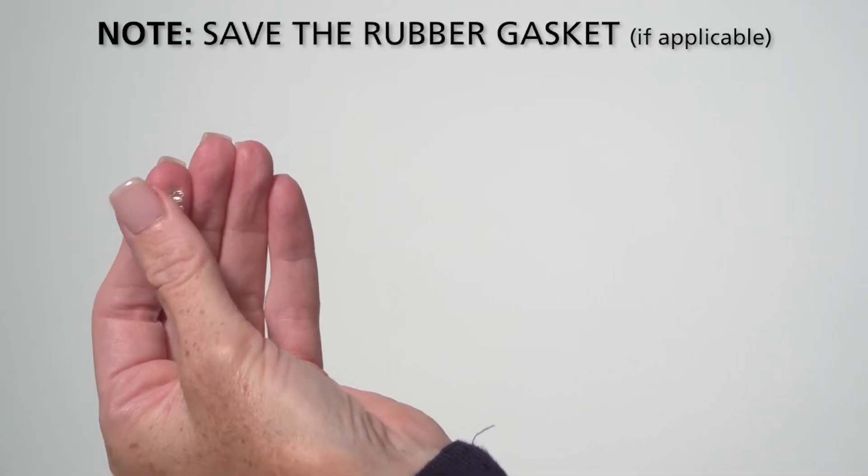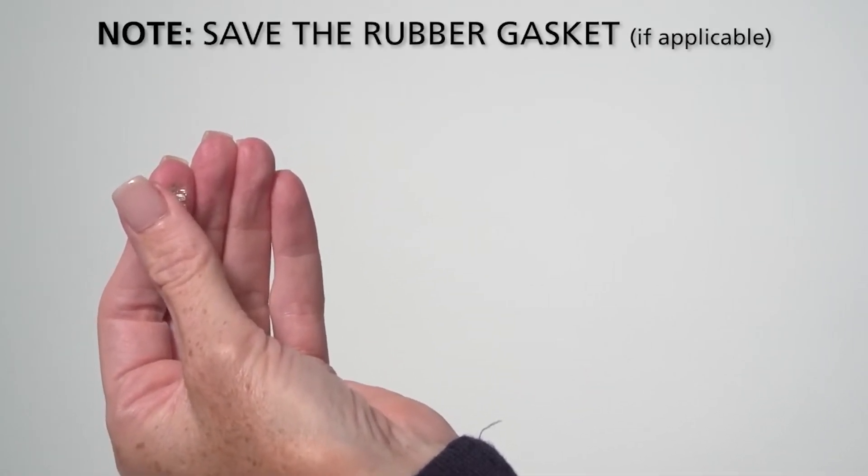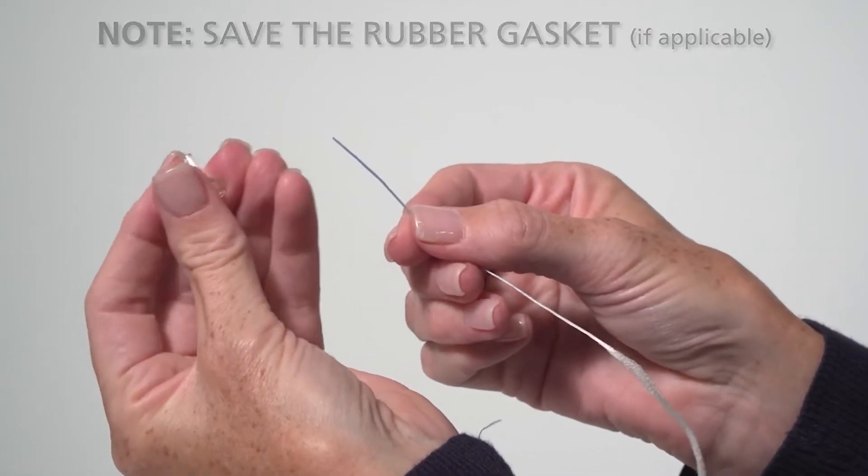Depending on the tympanometer used, there may be a rubber gasket. Do not discard this rubber piece as it must be in place when cleaning is completed.